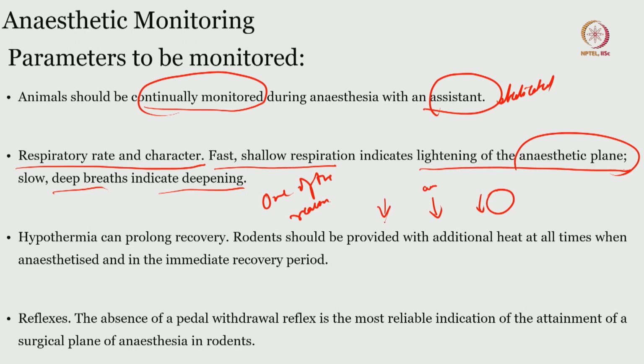That is either the loss of memory plane or a loss of consciousness state, which is just superficially sedated, not really unconscious. So, it is very important to look at the anesthetic plane, and that will be indicated directly either by the MAC or the dial setting that is being given, and if you can monitor the respiratory rate of the rat.